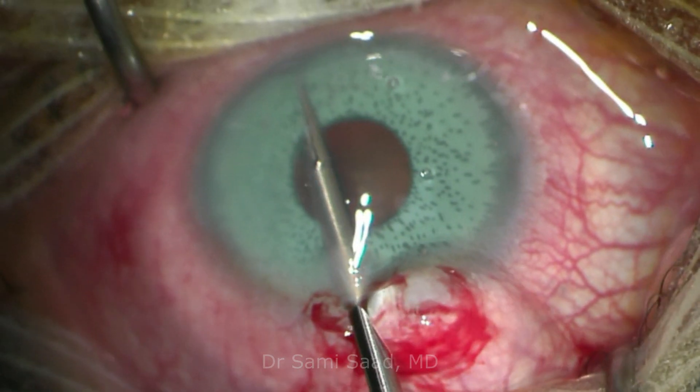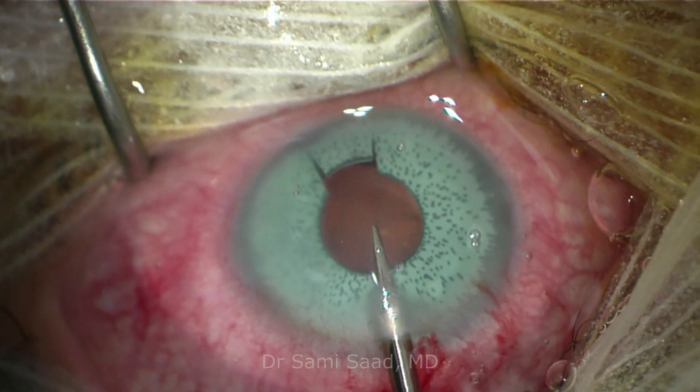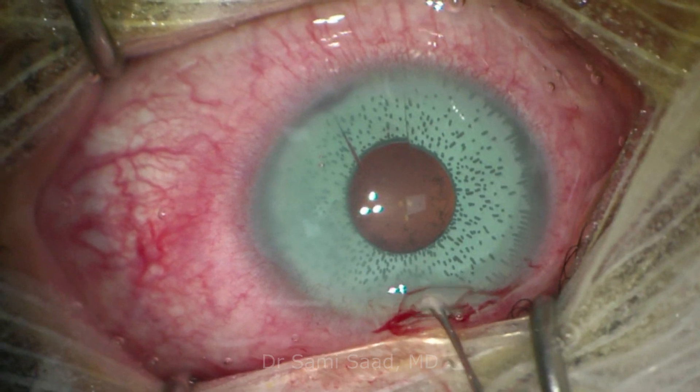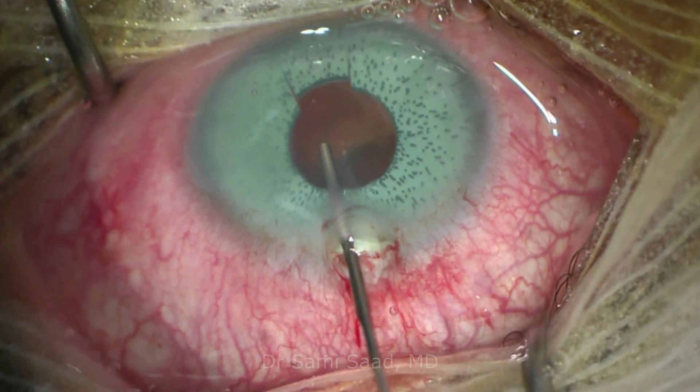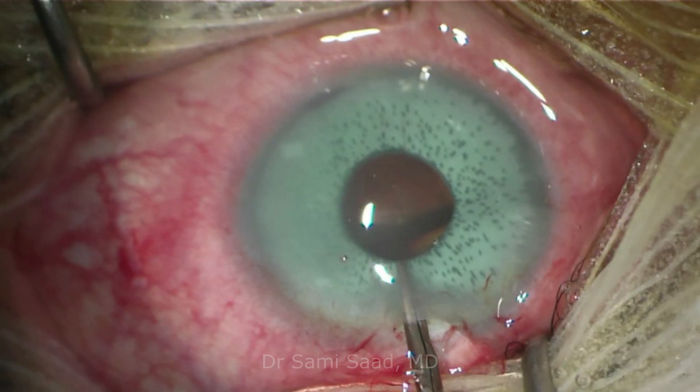We perform a superior clear corneal incision of 2.4 mm before injecting viscoelastic into the anterior chamber to protect the endothelial cells, and behind the artificial iris to separate it from the natural iris.